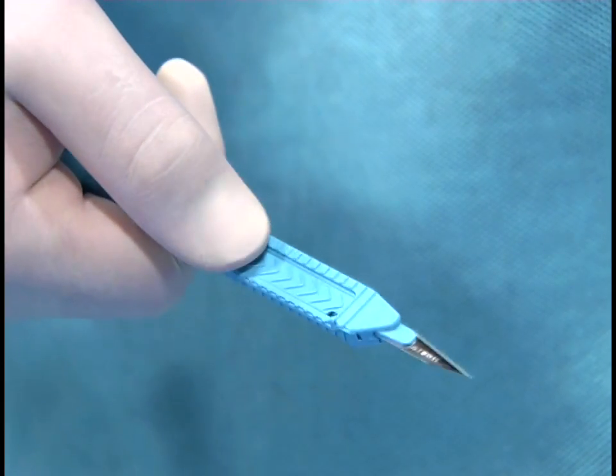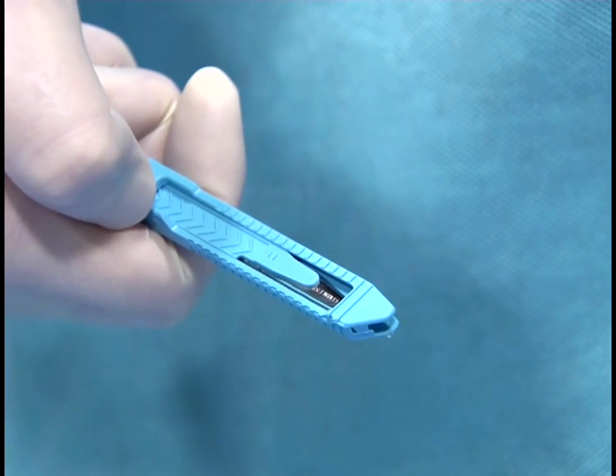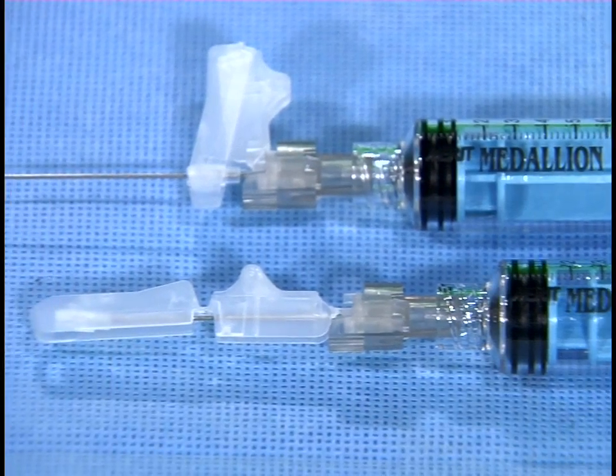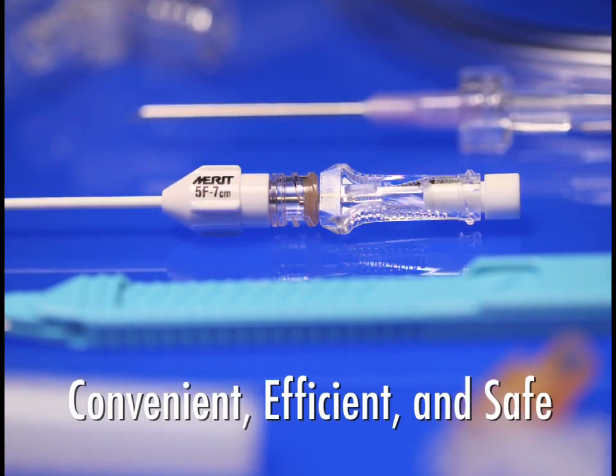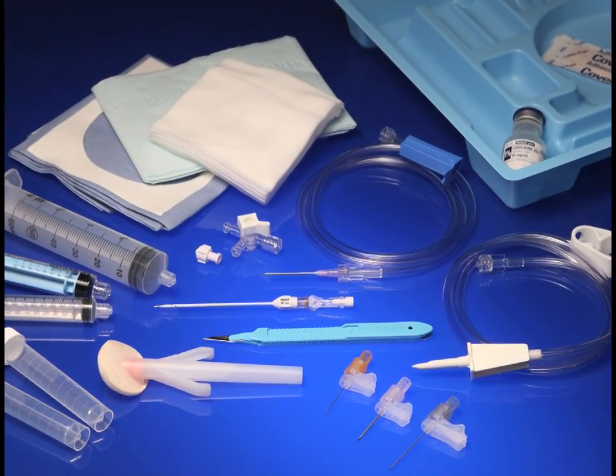For your safety, to help minimize the risks of sharps injury, the TAPS includes a Merit Futura safety scalpel and safety needles. Convenient, efficient, and safe — Merit Medical is your partner for Centesis procedures.